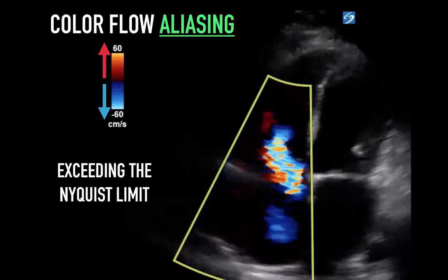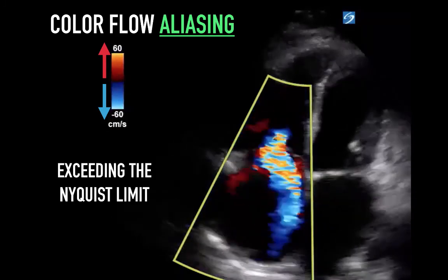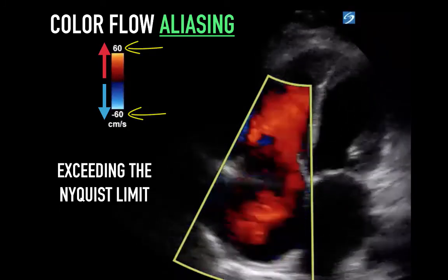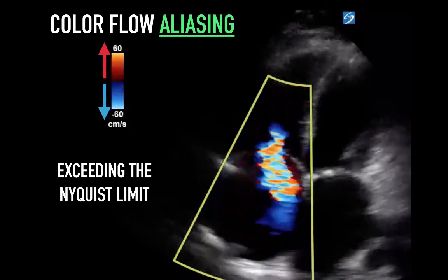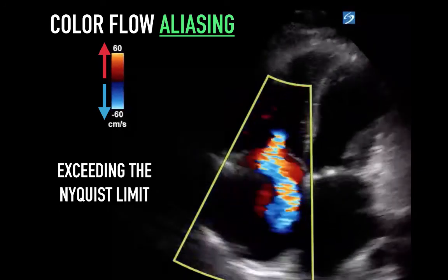Now, an interesting thing happens if you exceed the velocities in either direction. You get a phenomenon called aliasing. The maximum velocity on either side of the scale is referred to as the Nyquist limit. The maximum velocity the scale can work between. This means that once the velocity of blood flow in one direction exceeds the brightest red, the color will instantaneously change to the brightest blue, then gradually darken.